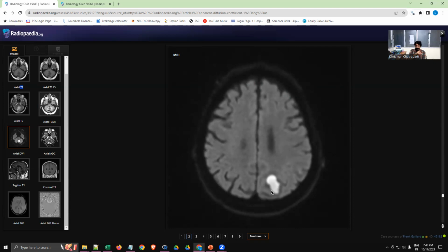it has water inside it because you confirmed that in the T2, but the water is not able to move. Normally, when water is in a space like CSF, inside the ventricles, it freely diffuses, because of which it will appear black on DWI. It will appear black on FLAIR also because it is pure water. Now in the FLAIR images, you saw that it was hypointense, but not completely black like the CSF. So that tells you that it is water mixed with something else. And water mixed with something else and not being able to move inside the cavity tells you that there's a true restriction of water movement there. So that basically means that it is something like an abscess, in which it is tightly packed water with proteins and fats and everything mixed together, and the water is not able to move anywhere else. Okay, so that is diffusion. That is how an abscess looks on an MRI scan, which you deduce from multiple images together.